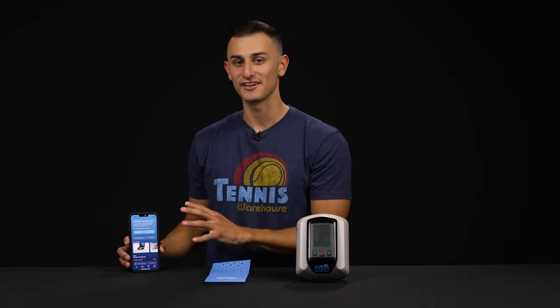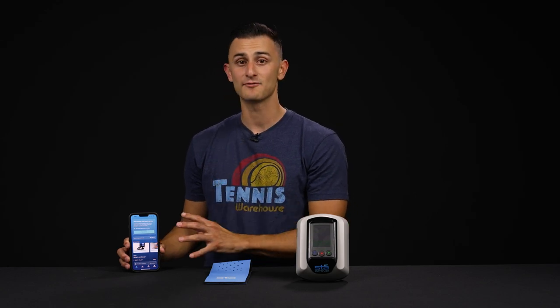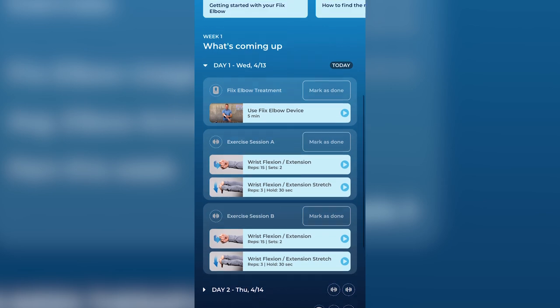Now we'll transition over to the app. This is what sets it apart from a lot of other competitors out there — it's easy to navigate, easy to set up. There's a survey that walks you through the setup process and tutorial videos as well. It takes you day by day, week by week through your recovery process.